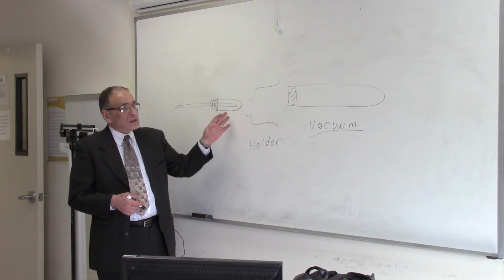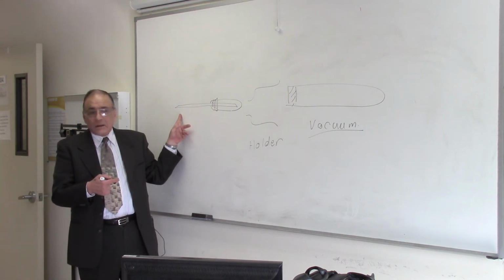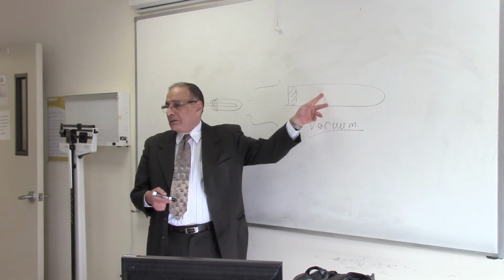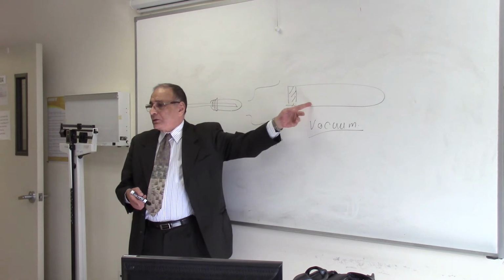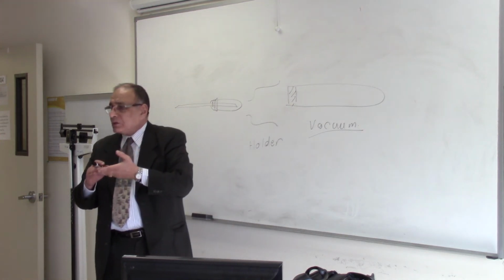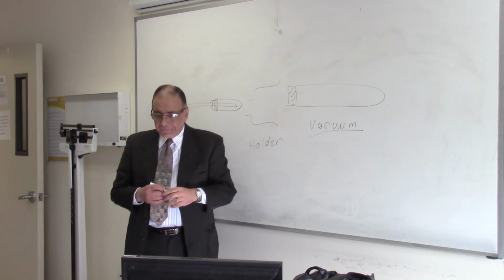When you're using this system, you use the needle inside the vein, and then the blood runs through the needle to the tube. Why? Because the pressure in the vein is higher than in the tube, and the fluid moves from high pressure to low pressure until the tube is filled two-thirds, and the pressure will be equal, and the blood stops by itself. Okay?